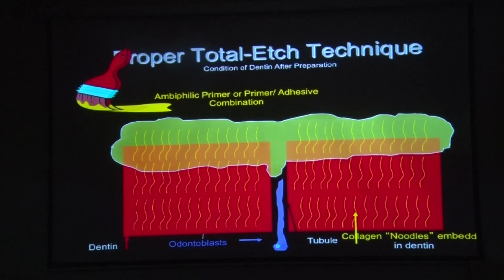If you're using a butanol based, that's the most forgiving, that's XP Bond, then it's giving you a lot of time to work with. So now what happened is initially when I was using Prime and Bond NT, I was a big fan of Prime and Bond NT. So we got some beautiful results. So we followed the instructions of Prime and Bond NT. But then we switched over to XP Bond. This can happen to anybody. You switch over to adhesives in no time. So when you switch to any kind of bond, know the instructions because chemistry is different. Now I started using XP Bond as Prime and Bond. That was called overconfidence.